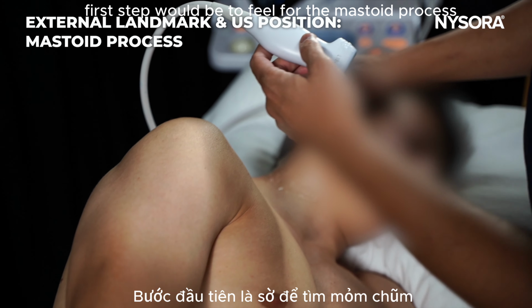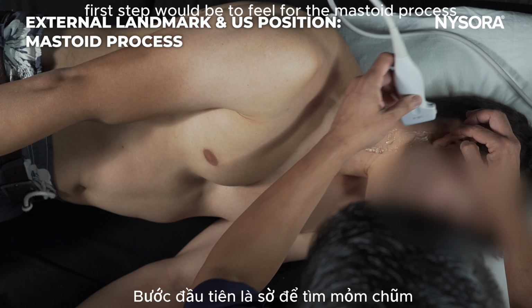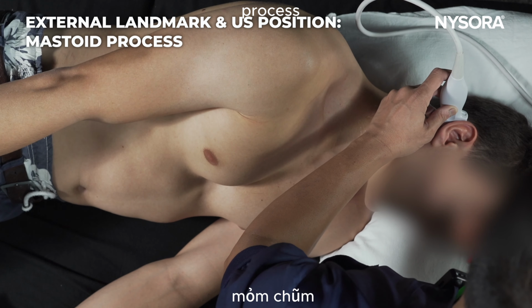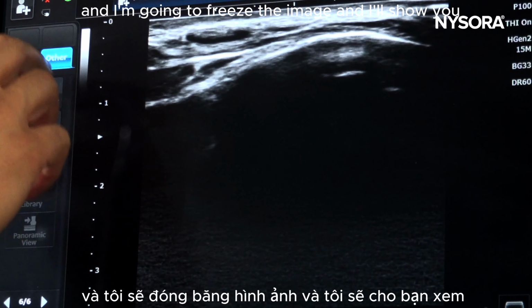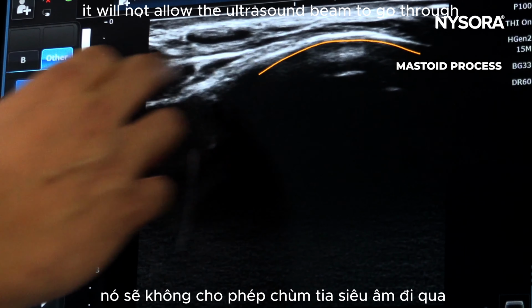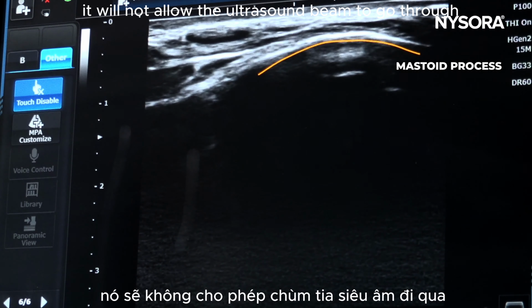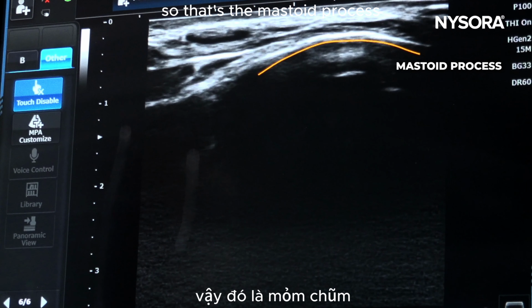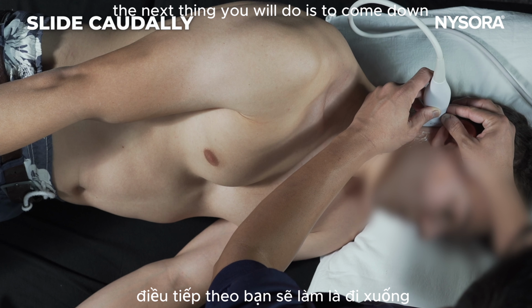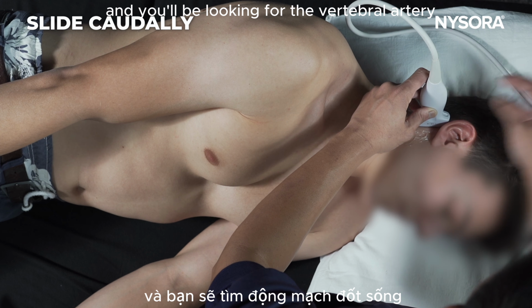Now, first step would be to feel for the mastoid process, and you put the ultrasound probe on top of the mastoid process, and I'm going to freeze the image and I'll show you. So mastoid being a bone, it will not allow the ultrasound beam to go through, so that's the mastoid process. Once you have looked at the mastoid process, the next thing you will do is to come down and you'll be looking for the vertebral artery.